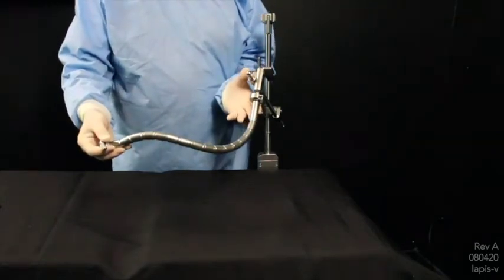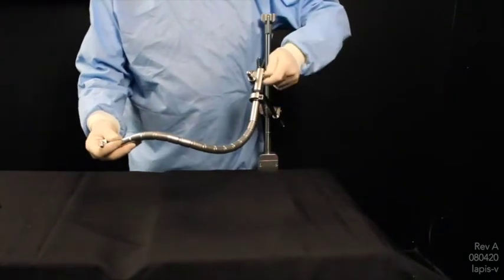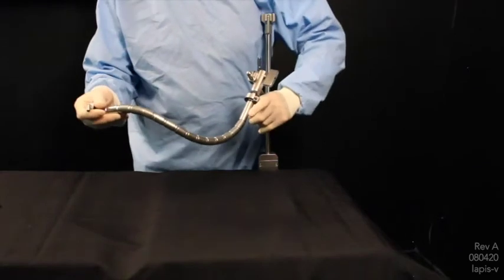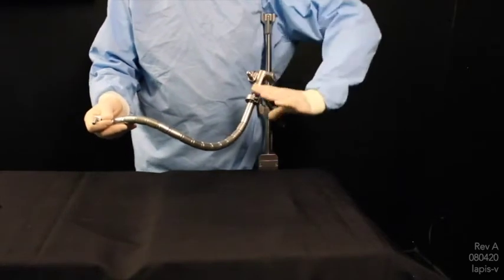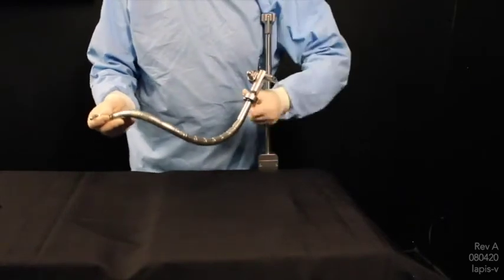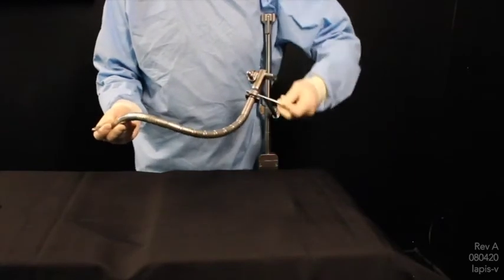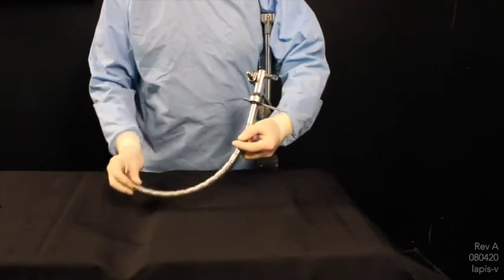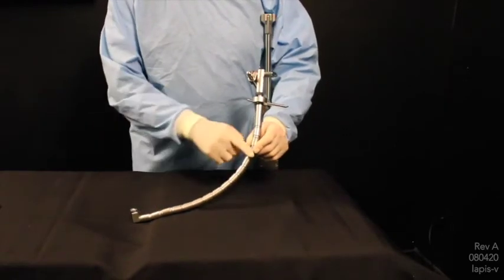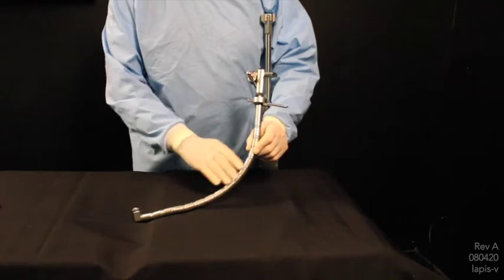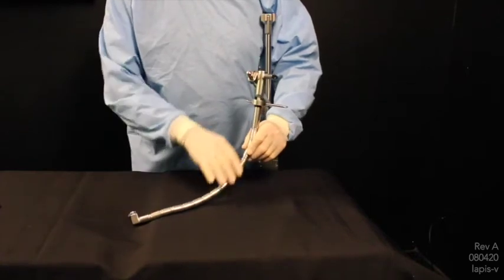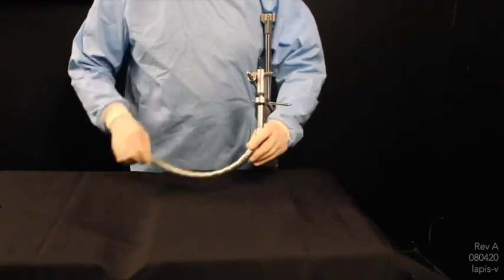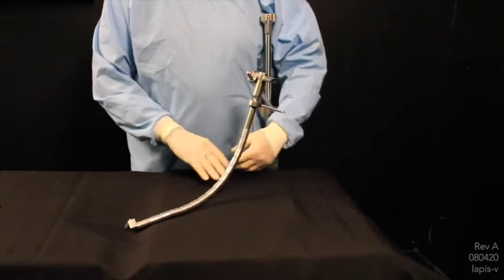Once a case is complete, always make sure to loosen the arm before sterilization. The arm must be completely flexible before sterilization. If not, this tends to wear out the coils that are within this arm itself. So always be sure that there is a complete flex before sending into sterilization.